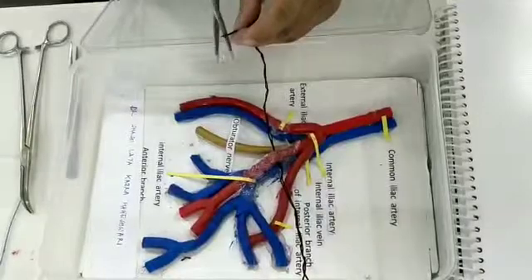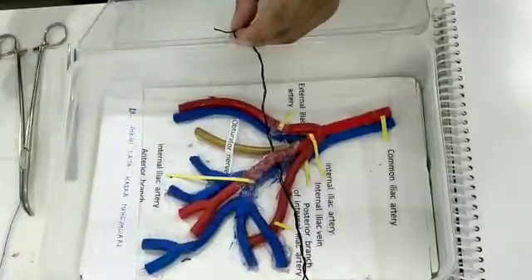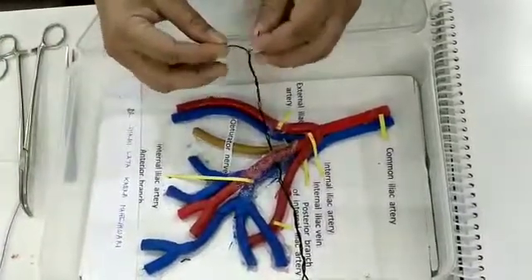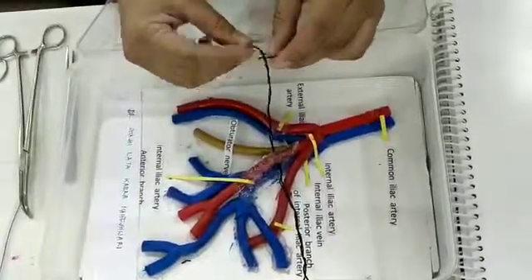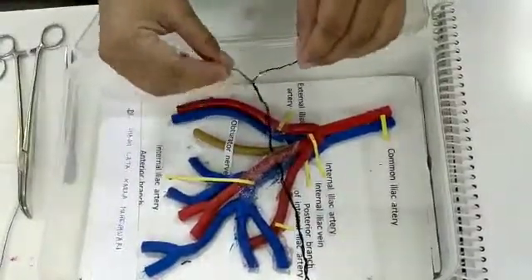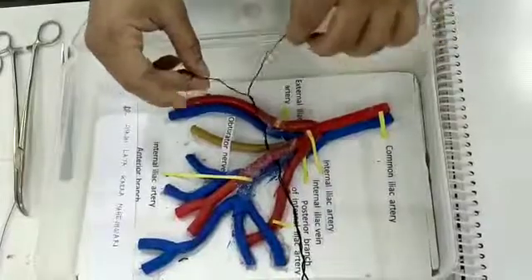This is the model which I myself made. I assembled many tubes in anatomical configuration and then I colored them and arranged them in this way.